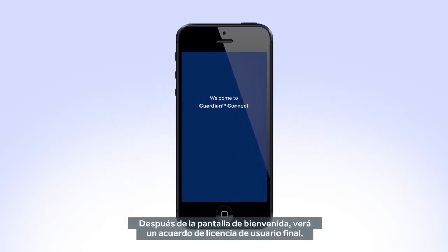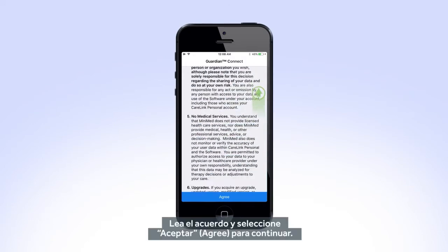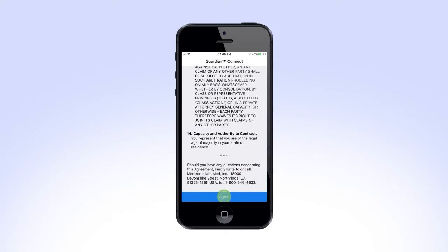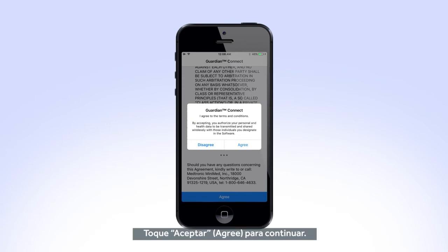After the welcome screen, you will see an end user license agreement. Read through the agreement and select Agree to proceed. You will get another prompt asking if you agree with the user terms and conditions. Tap Agree to continue.